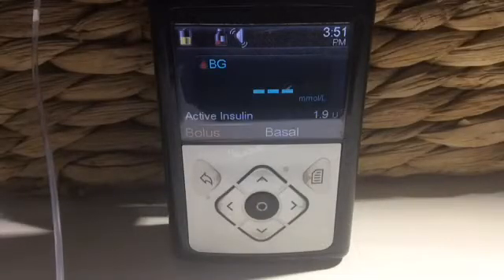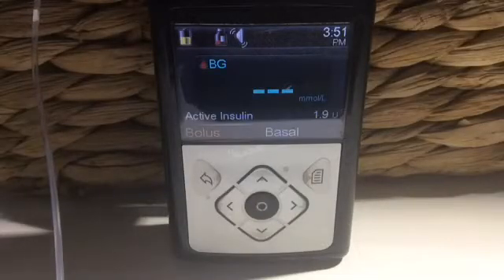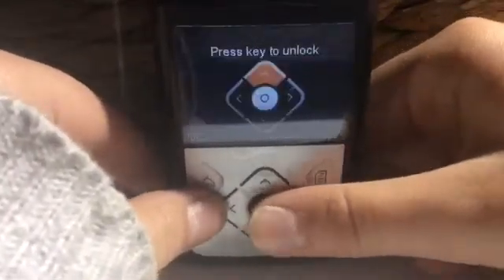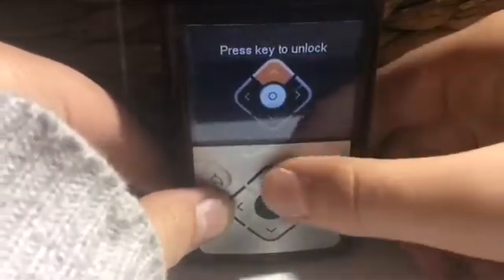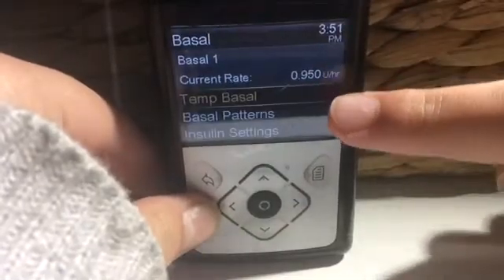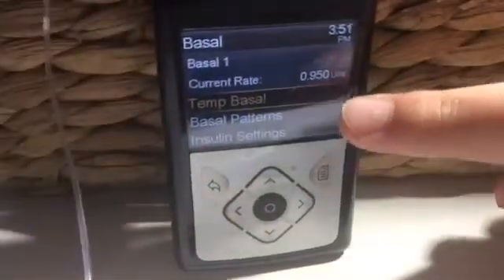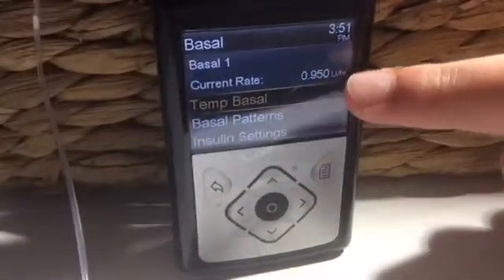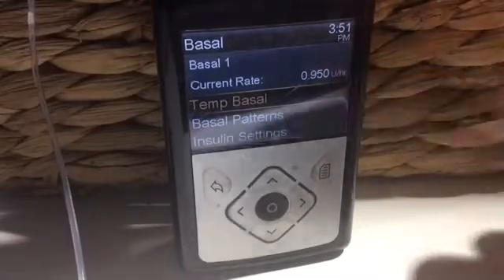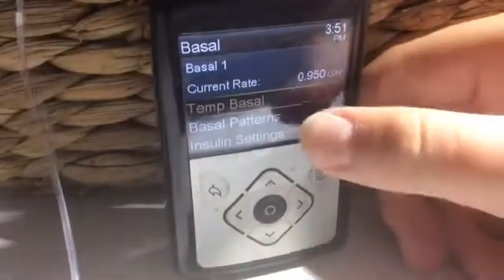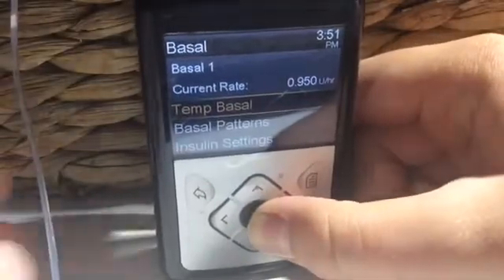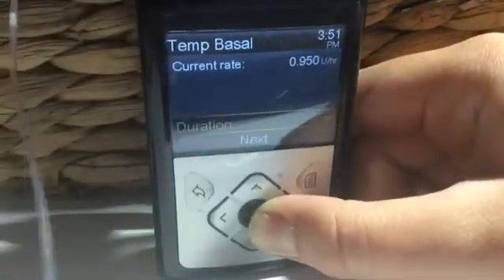Next, the basals. In the basal section, again you will see three different areas. Today we will just be talking about the temp basal and basal patterns. So first of all, the temp basal — this is used for various reasons: if you are sick, not feeling well, or if it's too hot.